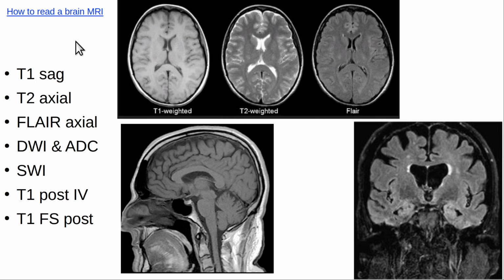Okay, this video is called How to Read a Brain MRI. I'm board certified in 3 fields. One of my fields is neuroradiology, and I look at these things every day, so I just want to share with you. This is going to be really simple, like a 5-minute lecture, and just stuff that you need to know to make sense out of a brain MRI.